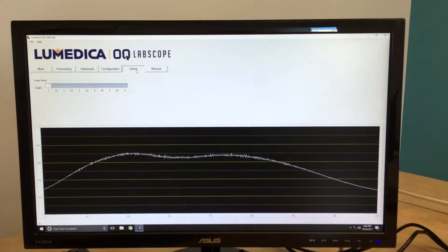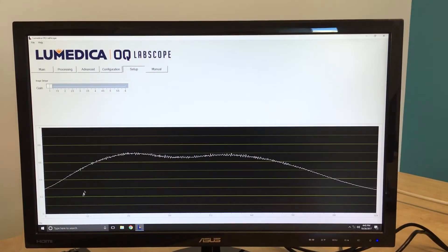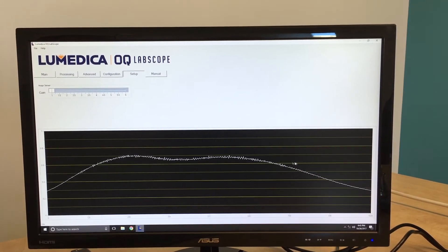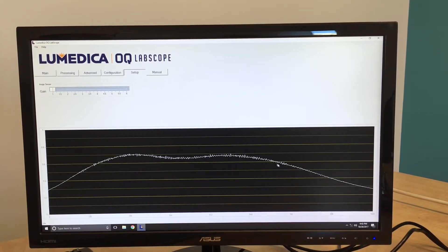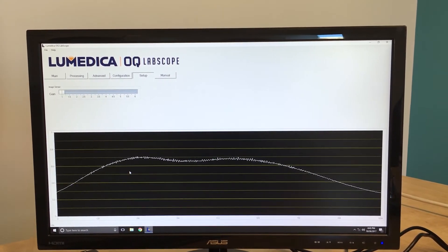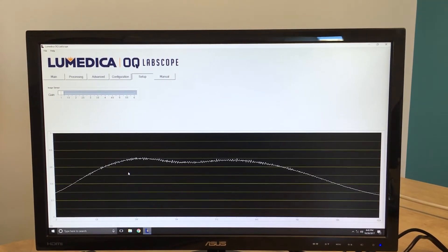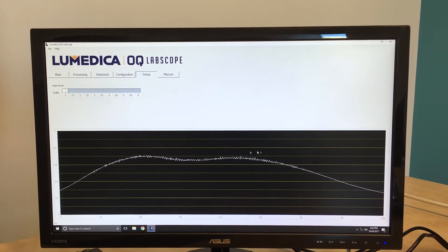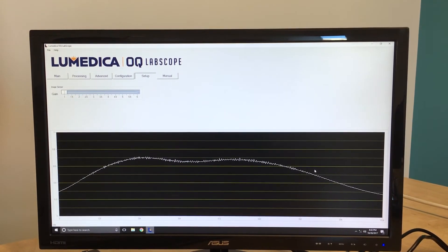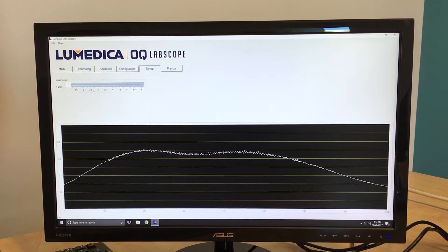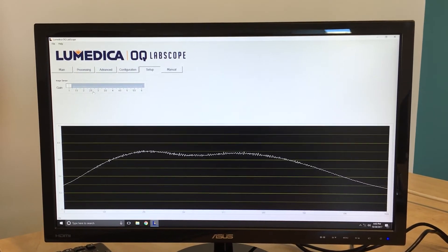The Setup tab shows you the raw data from the spectrometer, and here we can see our interference fringe, which is processed to form the image data. On this screen, you can examine the interferometric data directly, as well as control the gain of the sensor.